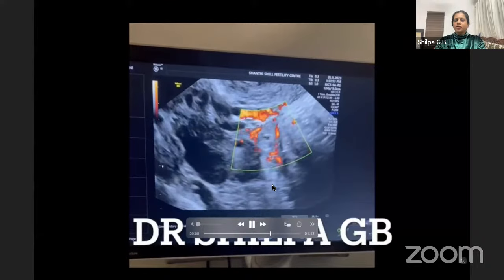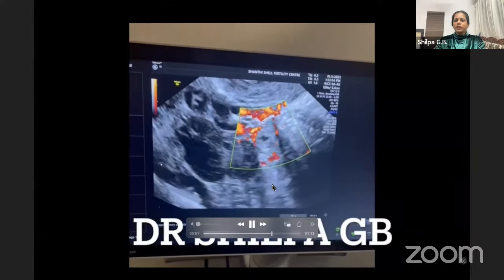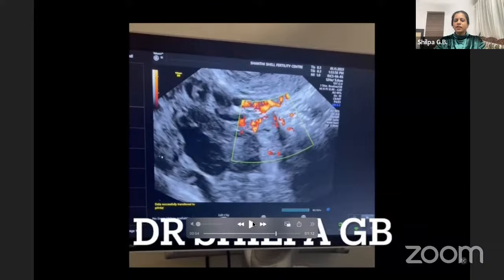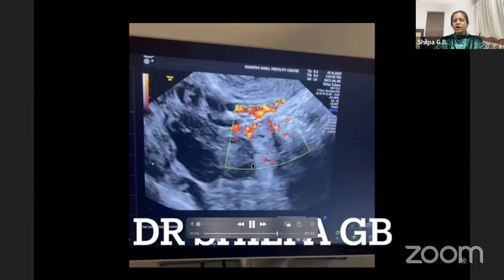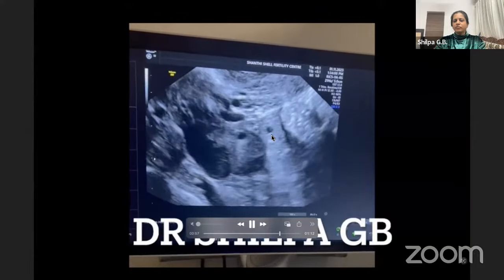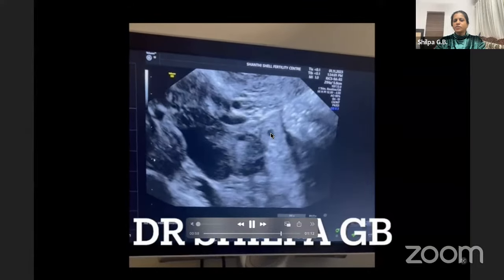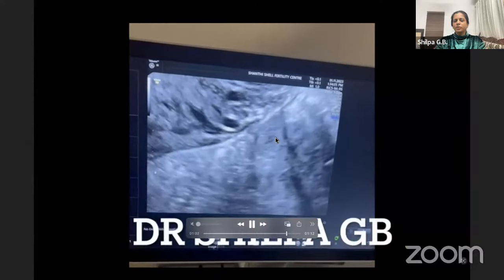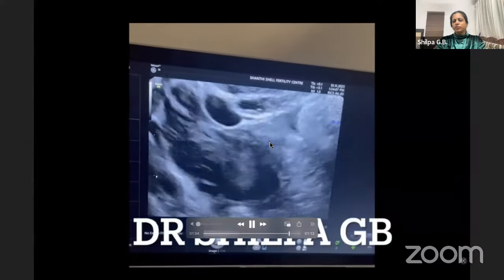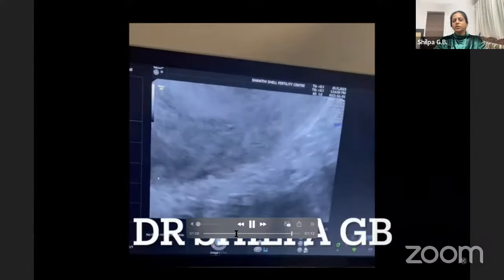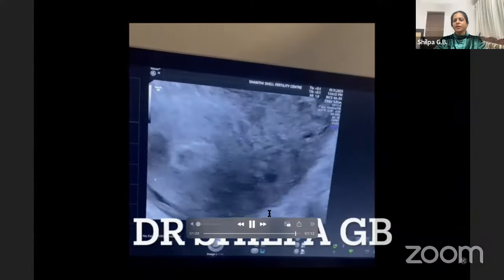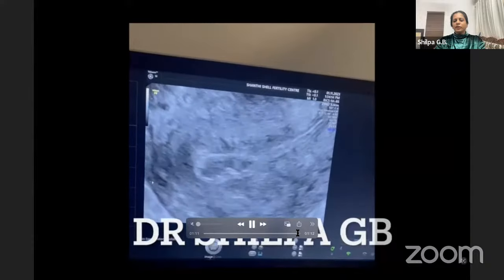You can see the ring of fire which is clearly visible here, where the blood flow is quite evident. The sac size in this case was about 0.4 to 0.5 centimeters and you can see a very small yolk sac inside also, which is again a clinching point to diagnose a gestational sac in the adnexa.